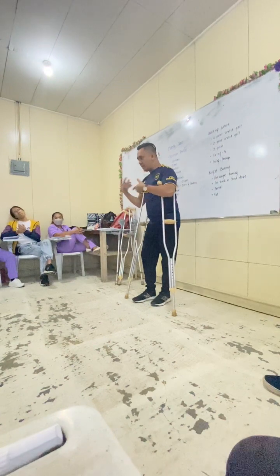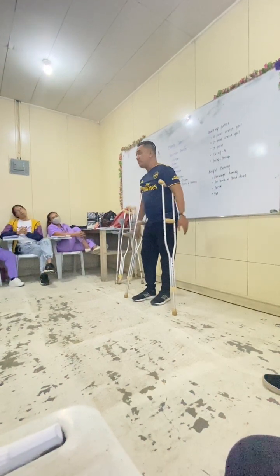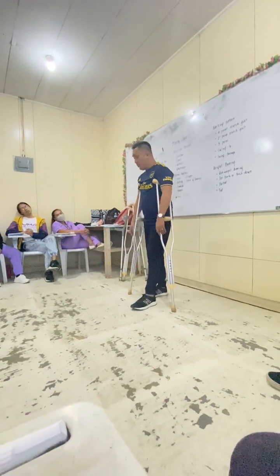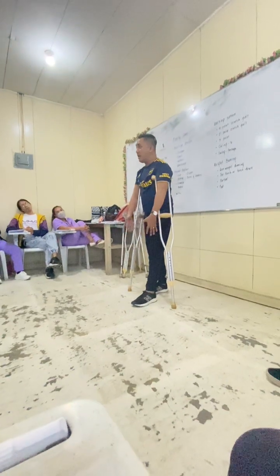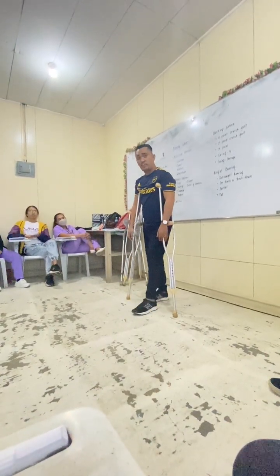Napapay sila yung mga clusters, I forget the term. Although they can put their foot on the floor, but because of that, di sila kabalance mo. That's why it needs an assistive device. But full weight bearing na siya.